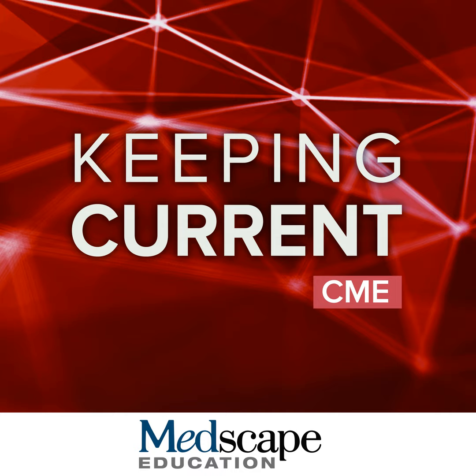So that's one example. We use it also to differentiate tumor progression from pseudo progression. So sometimes the effect of the treatment of the brain tumor result in imaging findings that look very much like tumor progression, but it's just the treatment effect. That's why it's called pseudo progression. And sometimes, again, perfusion imaging can help differentiate between those two conditions. You mentioned stroke, so perfusion imaging has also been used for stroke to try to characterize the penumbra, meaning not the infarct core, but the penumbra, the viable tissue that could be salvaged.